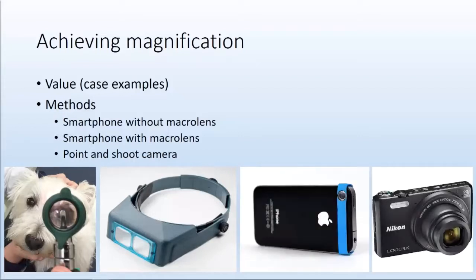What I'm going to talk about, and I'll distribute to as many people who are as interested, is this little blue rubber band, the Macrolens. And I don't have a financial relationship with it. This doesn't benefit me at all. I do get emails from the CEO of this company saying, what's happening? So he's very happy about it, but we haven't partnered up in any way, or just regular point and shoot cameras.